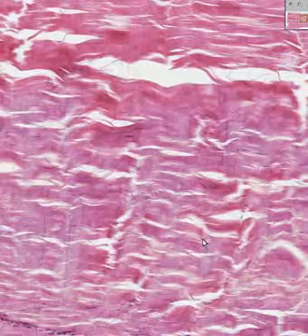Here is a type of connective tissue which we see in contrast to the loose areolar connective tissue, which we saw a little bit earlier. This is also classical connective tissue, which means the majority of the substance is collagen and the majority of the nuclei that you see, often spindly, are fibroblasts.